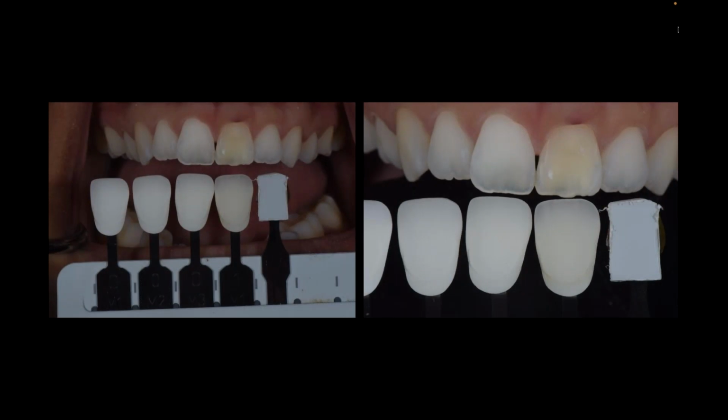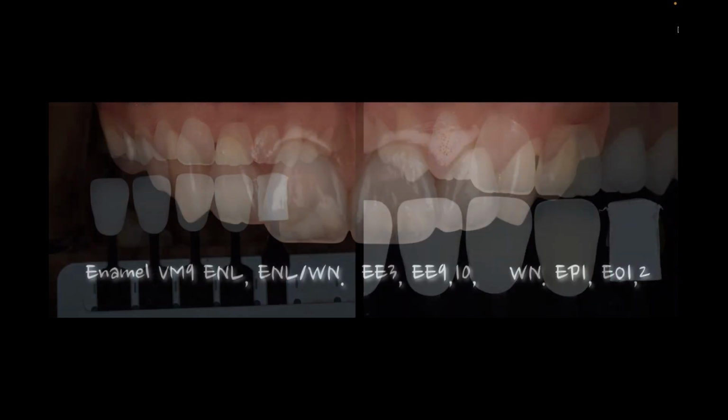Obviously, polarize is really important in these photographs. I also referenced this with the Easy Shade, and I'm actually using something called OptiShade more today, which is another interesting shade taking device. But this was a few years ago, so none of those things really applied, although I did use the Easy Shade. But you'll also notice the amount of translucency you're seeing there with the polarized photograph. So think about that concept. I only have 3/4 of a millimeter to work in. This is going to be all enamels.